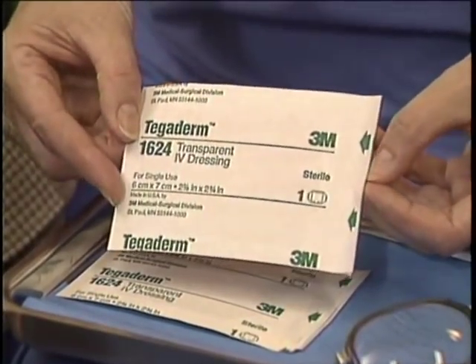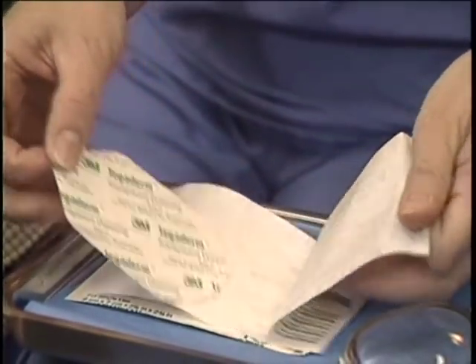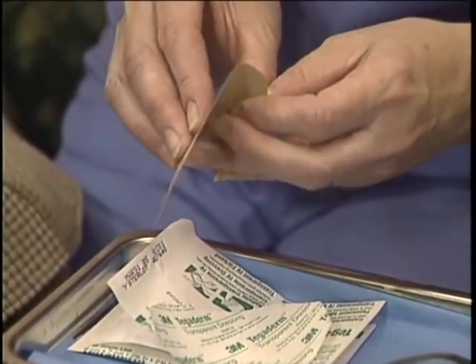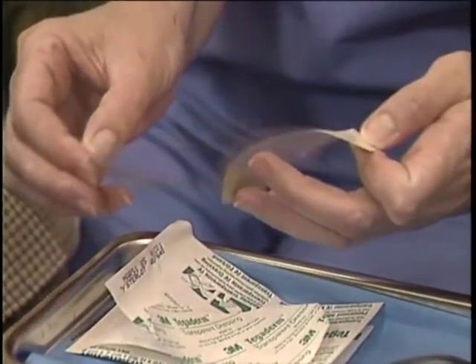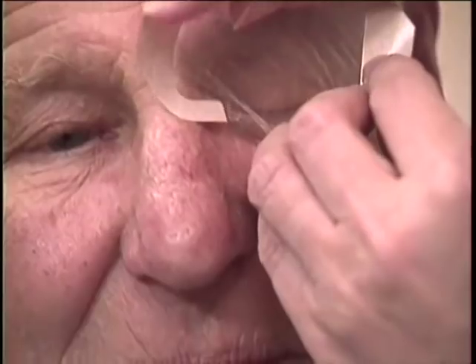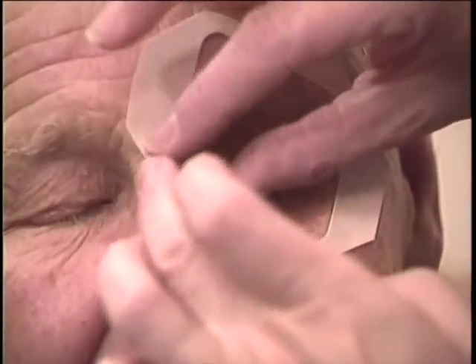Because a prolonged duration lid block is part of the described technique, a clear plastic dressing — 3M's Tegaderm — is applied at the conclusion of surgery. It is left in place until the next morning, at which time it is removed by the patient or relative prior to return to the eye clinic for routine first-day checking. By using this method, in which the eyes and lids are sealed in a closed environment, a former occasional problem with corneal drying or abrasion has been overcome. An added advantage is that spectacle wearers can use their glasses without difficulty on leaving the surgical centre.